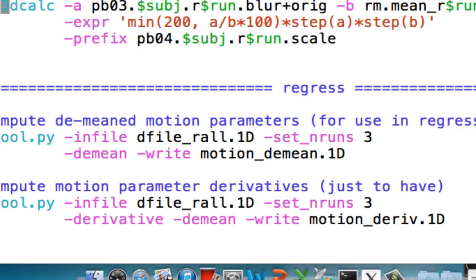The way that AFNI does this, and it's similar to other programs like SPM and FSL, is it scales everything relative to the mean. So it makes the mean across each run 100, and then it scales everything based off of that.